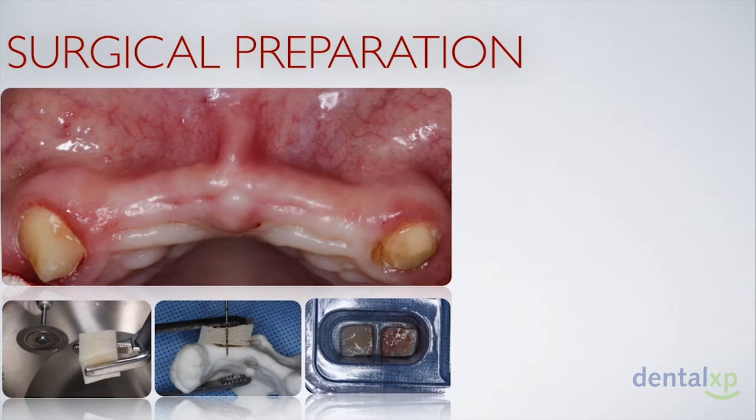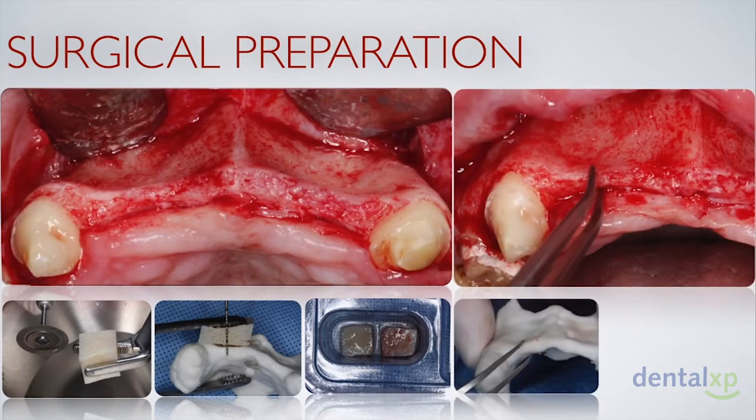Also, in an attempt to enhance the bioactivity of these blocks, we utilized GEM21 as a hydration medium following saline, in order to increase the chemotactic and mitotic cellular activity in the surgical site. So as you can see, the site was accessed, a very similar representation to what was shown on the CAT scan and the 3D printed models.